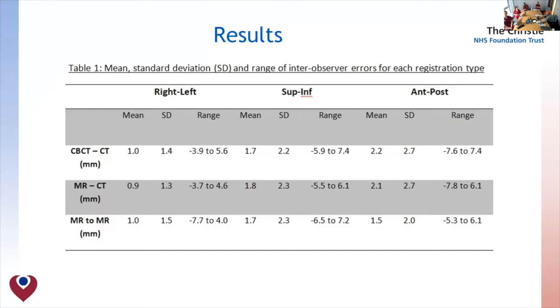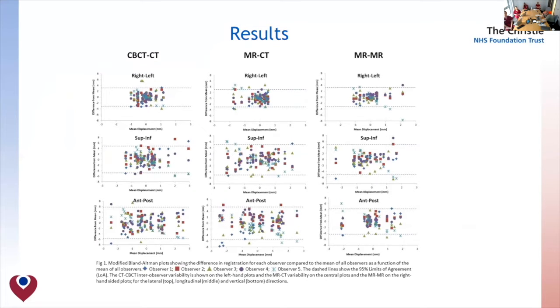And to evaluate consistency of agreement, well, yeah, we used Bland-Altman. We used modified Bland-Altman plots, and this process, as you've seen from David's little talk, establishes limits of agreement, and these can be compared to a threshold. And to assess clinical significance, we opted for a threshold set of 5 millimeters, which is based on our departmental ITV to PTV expansion margin for Embrace 2 patients.